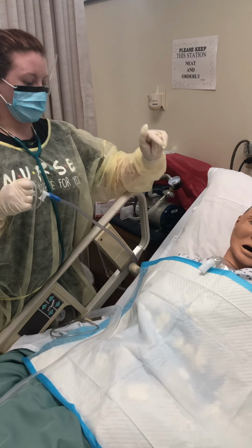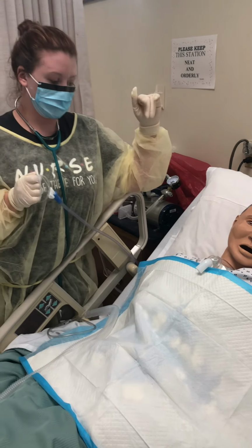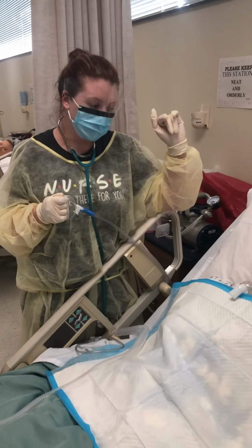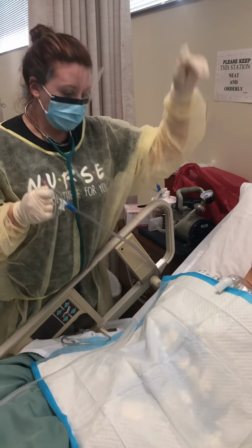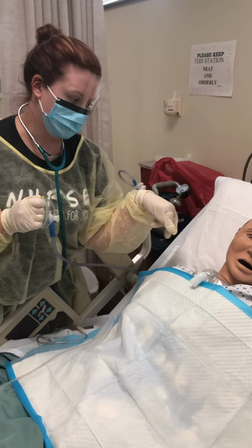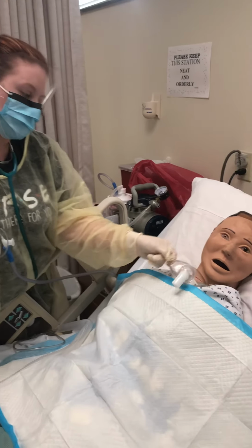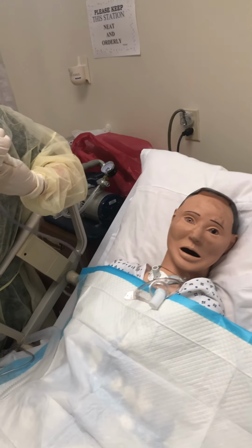And I am going to go down into the trach 4 to 5 inches, and if I meet resistance or the patient starts to cough, I'm going to withdraw the catheter a 1/2 inch, and I don't want to suction any longer than 15 seconds. So now I'm going to go ahead and remove the oxygen source and get ready to suction.